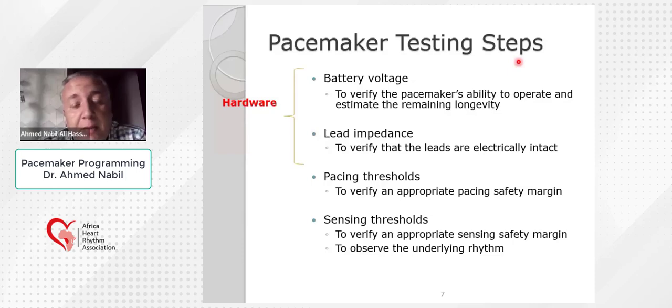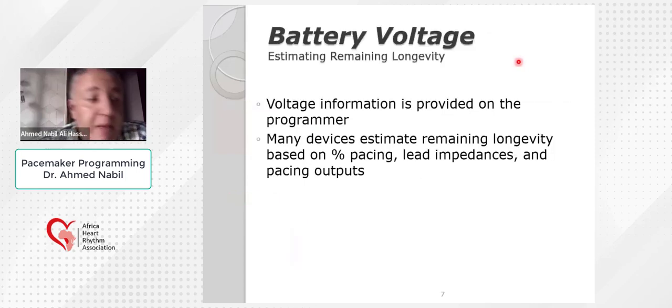And we measure the pacing threshold and the sensing threshold, or the pacing and sensing functions, which are the software, or the function, of the pacemaker. We will start with the battery voltage.